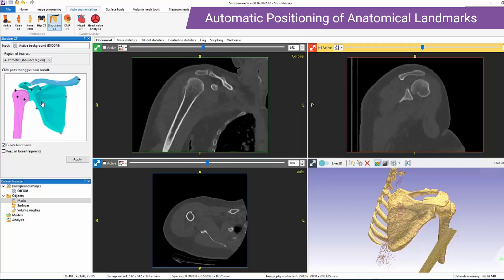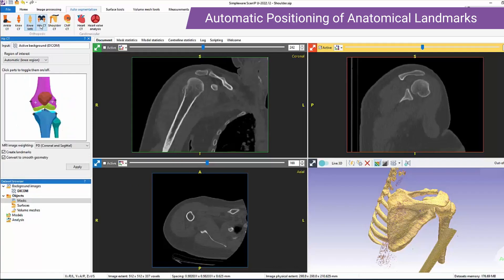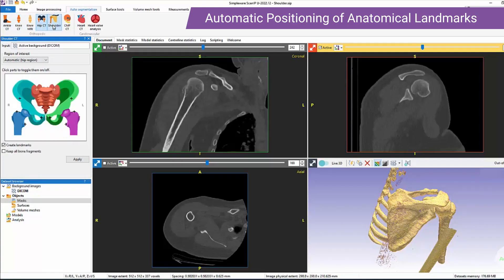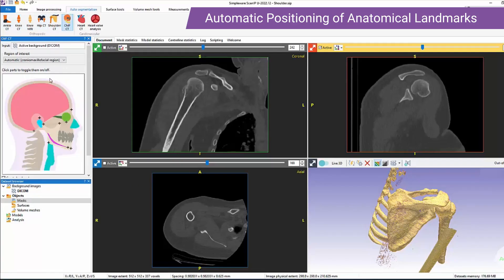The anatomies and scan modalities within ASOrtho include ankle CT, knee CT, knee MRI, hip CT, and most recently the shoulder CT and CMF CT.